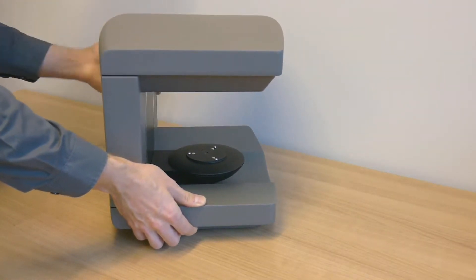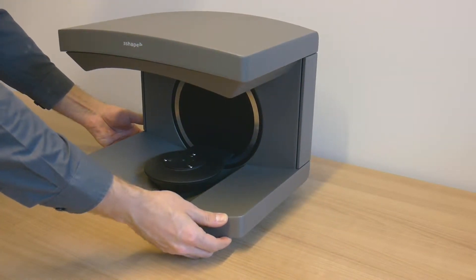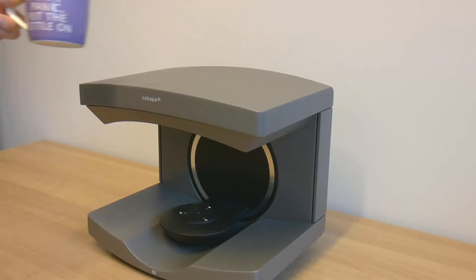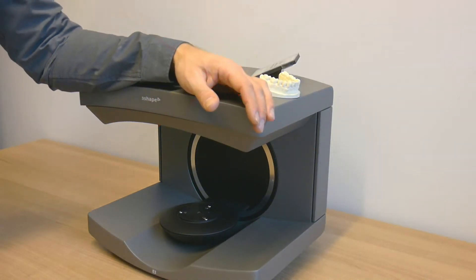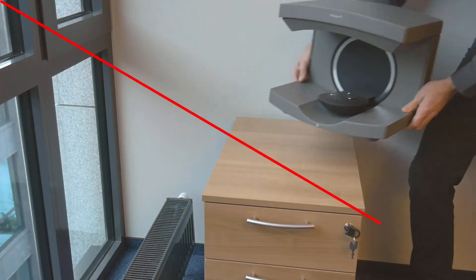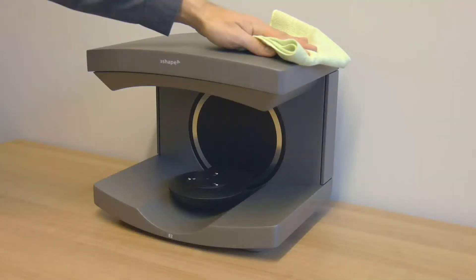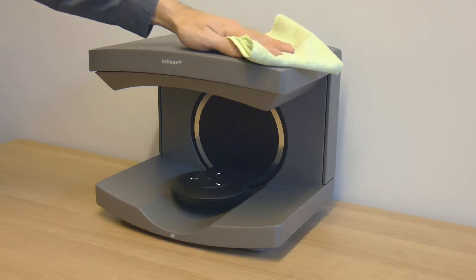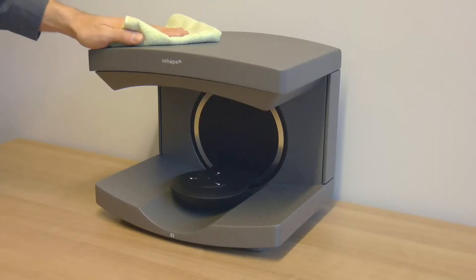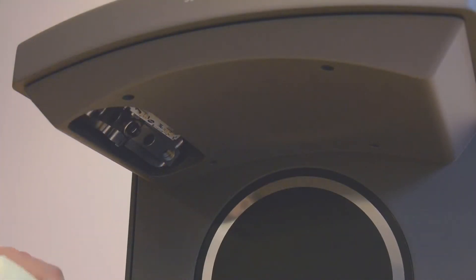Place the scanner on a stable, horizontal surface. The placement and proper use of the scanner is very important. To ensure safe operation and good performance, do not place objects on the unit or climb or lean on it. Do not place the unit in direct sunlight or in locations that may become abnormally hot, and be careful of places with heat sources. Do not place the unit in a wet or very dusty area. The scanner may be cleaned with a dry or moist cloth, but you should not use cleaning solvents and you should not clean the cameras.